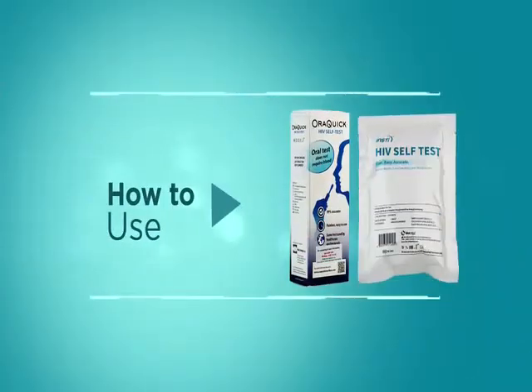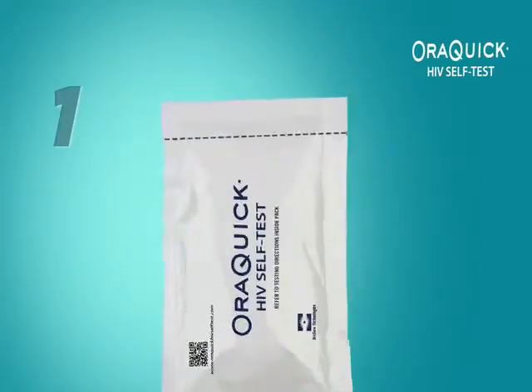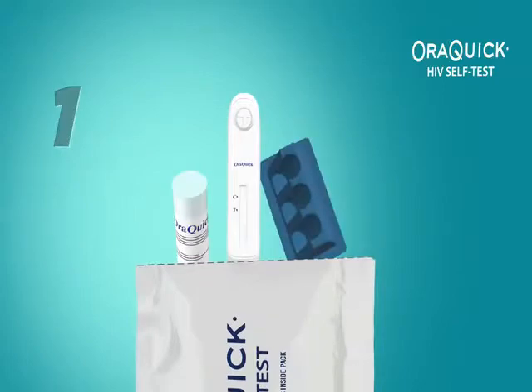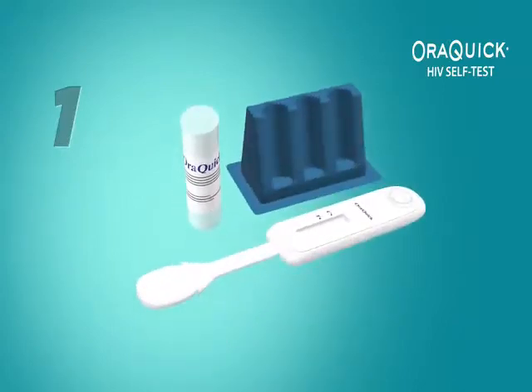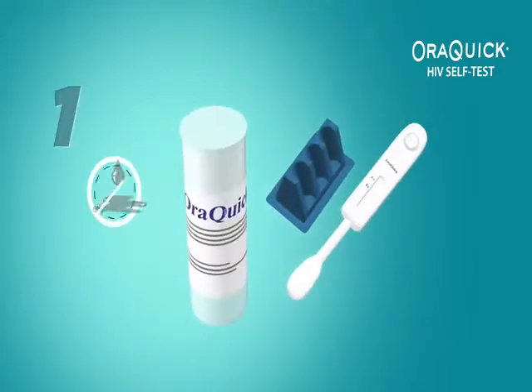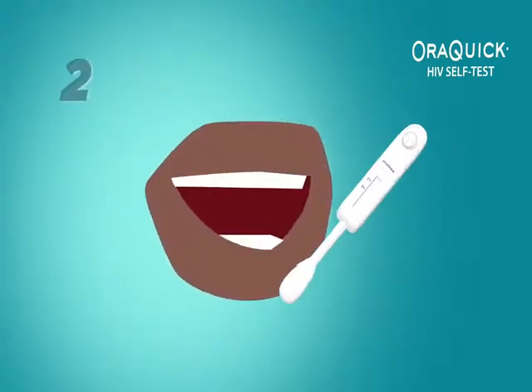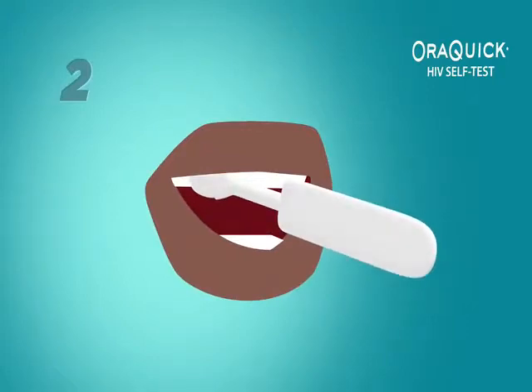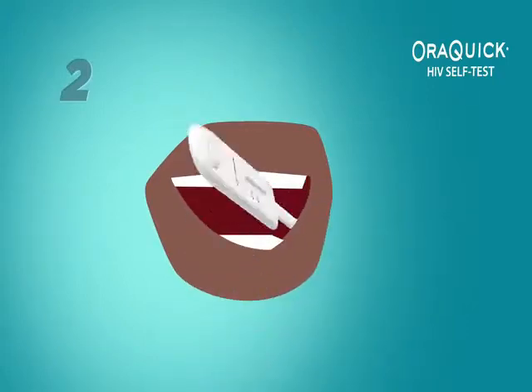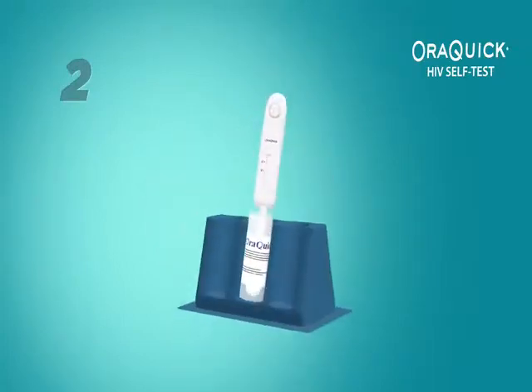Here's how to use the HIV Self-Testing Kit. Step 1: For Aura Quick, tear open the pouch containing the test device and tube. Do not touch the flat pad with your fingers. Do not spill or drink the contents. Step 2: Press the flat pad firmly against your gum and swab it along your upper gum once and your lower gum once. Leave it there for 20 minutes before reading the results.